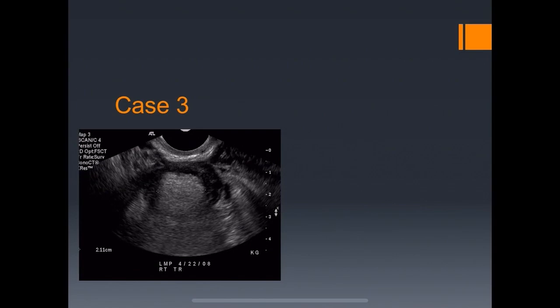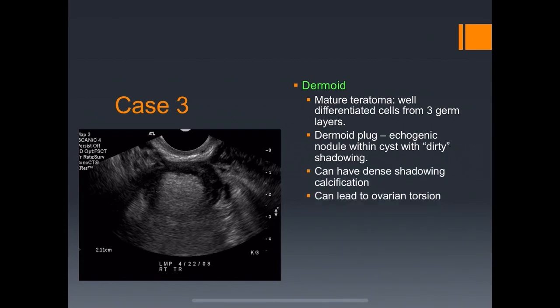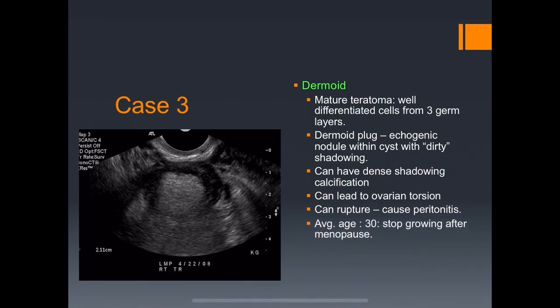Case three: this lesion is typical of a dermoid — a mature teratoma with well-differentiated cells from three germ layers. This is typical of the dermoid plug: an echogenic nodule with dirty shadowing. They can have calcification, can lead to ovarian torsion if large enough, and if they rupture can cause chemical peritonitis. Average age is 30 but they stop growing after menopause; malignant transformation can occur in older patients.